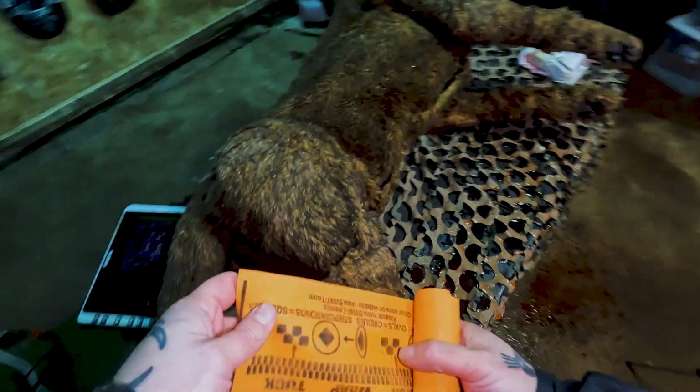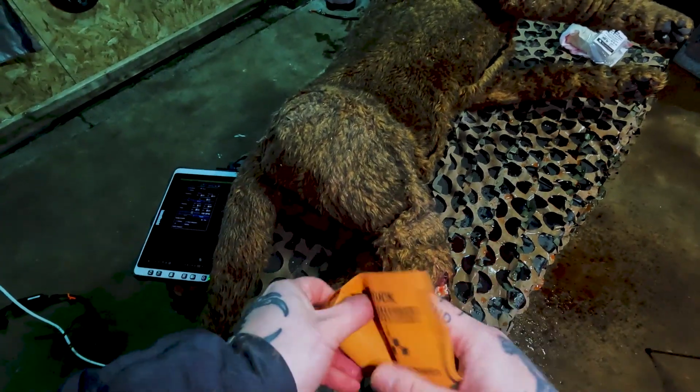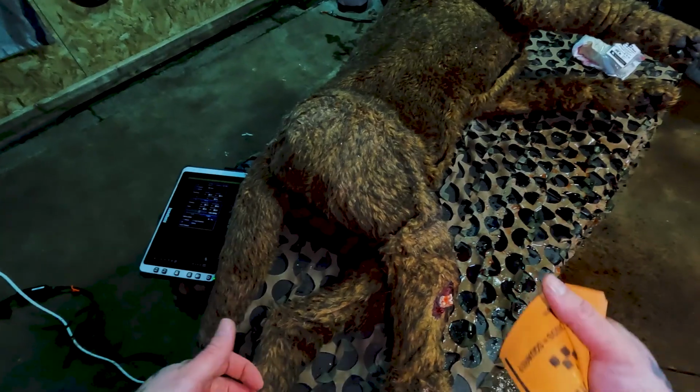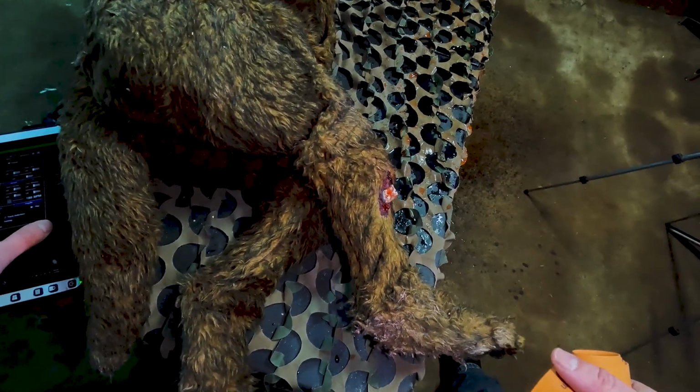Same thing with the ACE wrap. The SWAT-T just kind of does it better and faster without having to put as much effort into stretching the bandage out and getting tension on it. So again, if you have any kind of massive arterial spray, you want to grab the leg and stop the bleeding.